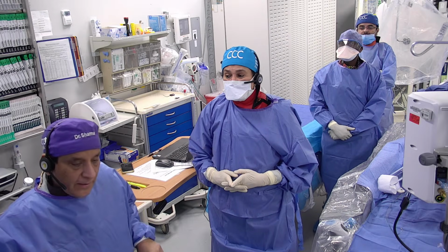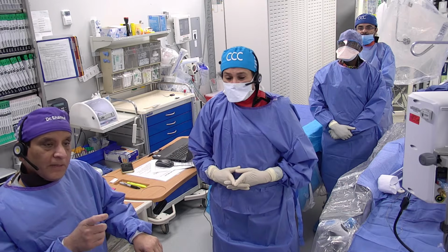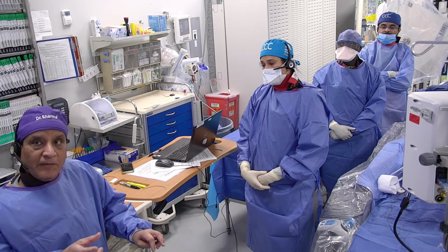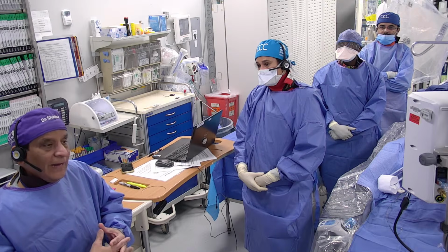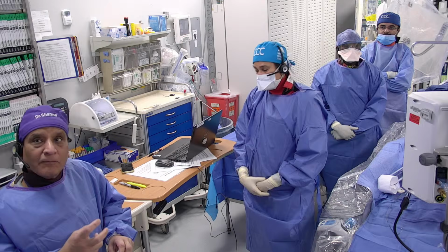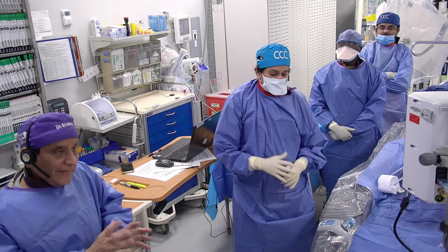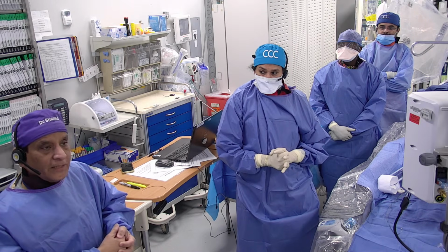The only question is, I'll tell you what happened. In this particular case, you have a small valve. So if you have to put in a 20 or 23 Sapien versus the Evolut, this was basically the 23 millimeter Evolut which we did. If you put in a Sapien valve, the valve area will be 1.6, 1.7, but with a 23 core valve, Evolut valve, your valve area will be 1.9 to 2, about 2. So therefore, ideally, if the annulus is not an issue, all patients with coronary artery disease should get a Sapien valve.